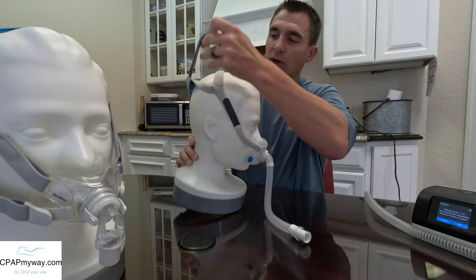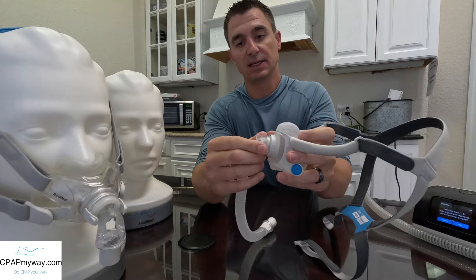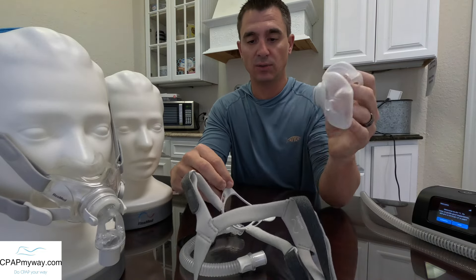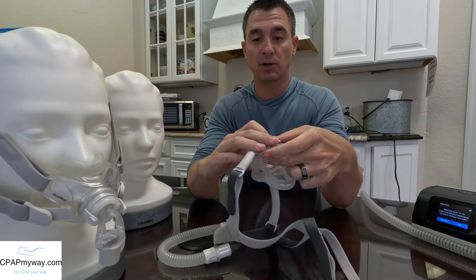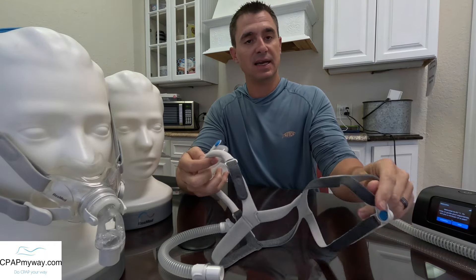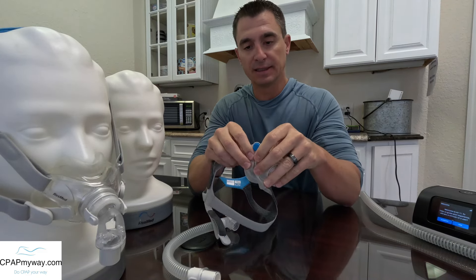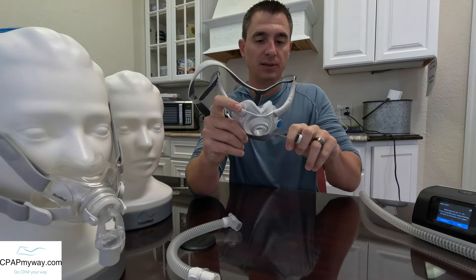As far as the overall ease of maintenance and taking it apart, it is just as simple, if not simpler. Your quick attach is no longer just an elbow — it's a long tube. Taking your cushion out — you literally just rip it out of there. There's no real wrong way to do it. The frame is flexible, the cushion's flexible, nothing to break, and you can't do it the wrong way putting it back together. Same magnet or headgear magnet attachments — those are really simple on and off. There is nothing to screw up on this one. It's a very user-friendly mask, especially if you've got some dexterity issues.